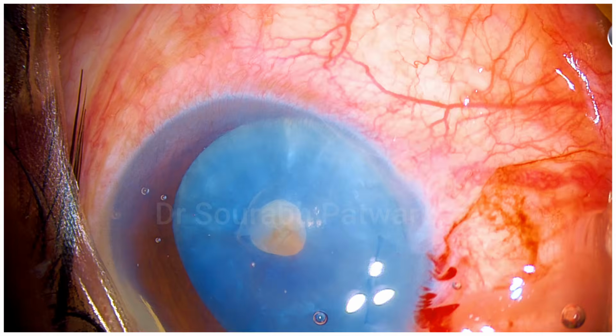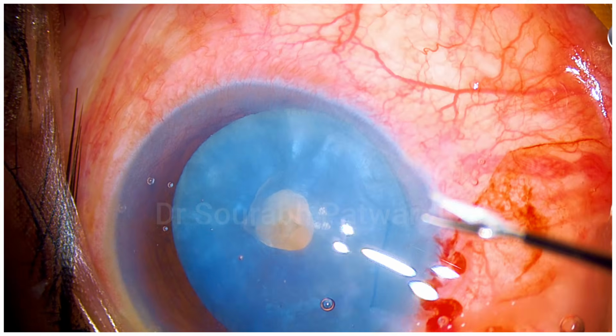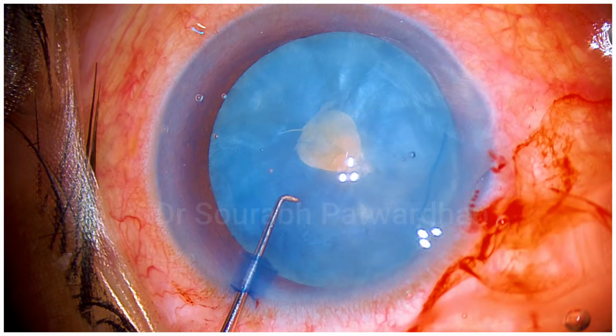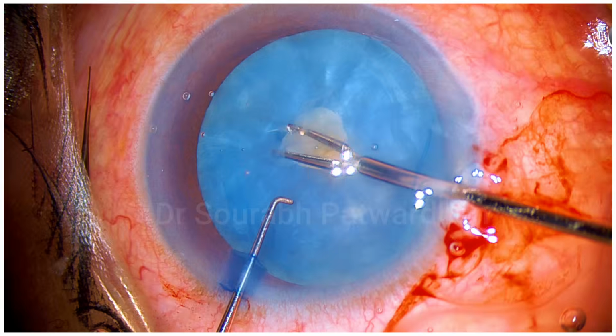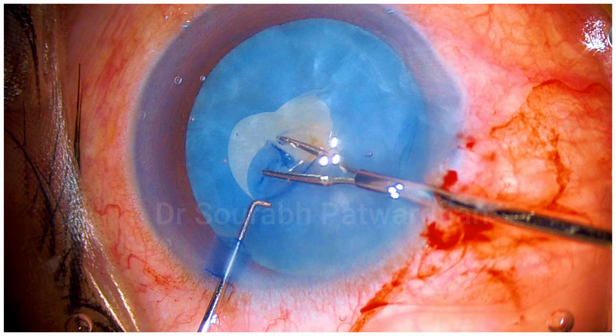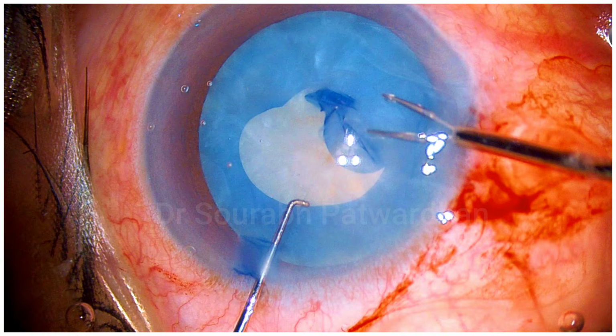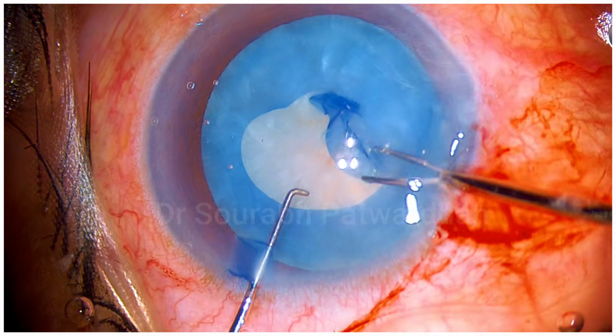Now, even after removing this intumescent, we have to still be careful about the risks I have told in the first video. So, watch now what the surgeon is doing. So, the first flap is made, it's well within the 5 mm circle, and when the surgeon pulls it later, you can see the surgeon is carefully focusing on the angle at which the rhexis is left at the end of its movement. So it's still going inwards. There is no outward angle to the capsulorhexis edge there, and it's within the 5 mm circle.